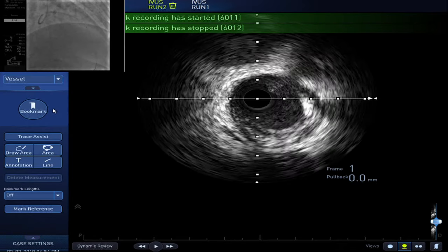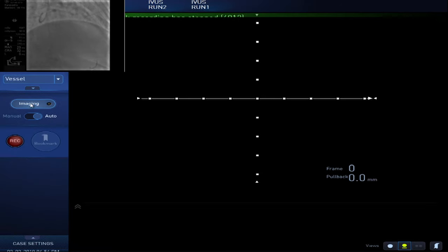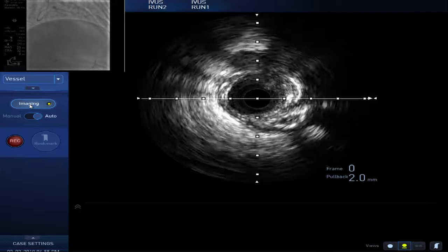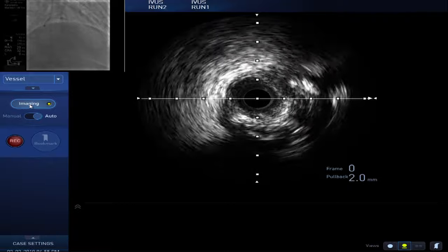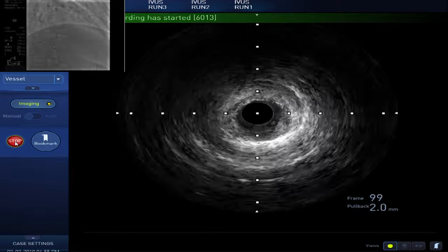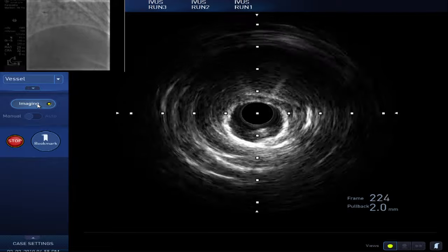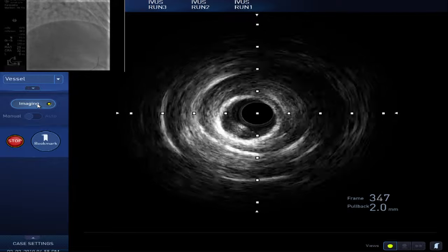Calcium is nearly... It's off. Leave it live. Yes. There's a 360 degree. Yeah. Trying to see where. Yes. One part should be. Wow, this is a very fast pullback. The blood pressure is down. Guys, pressure. This is 10 millimeters per second now.